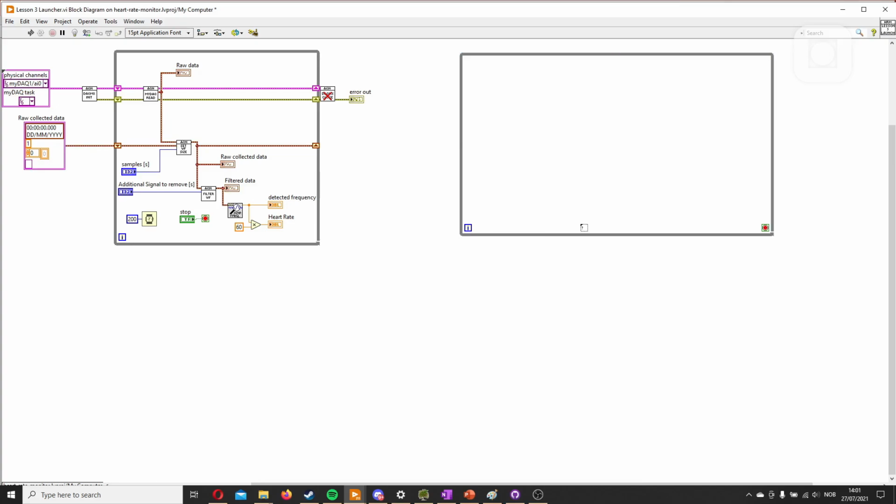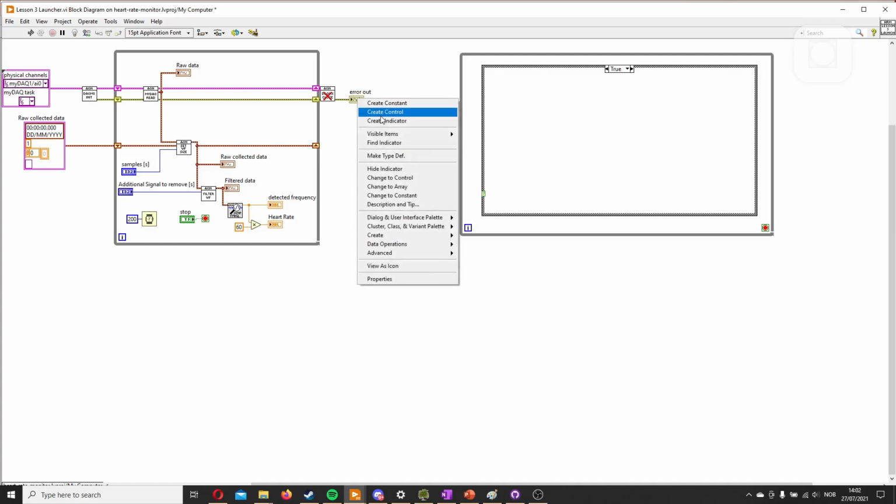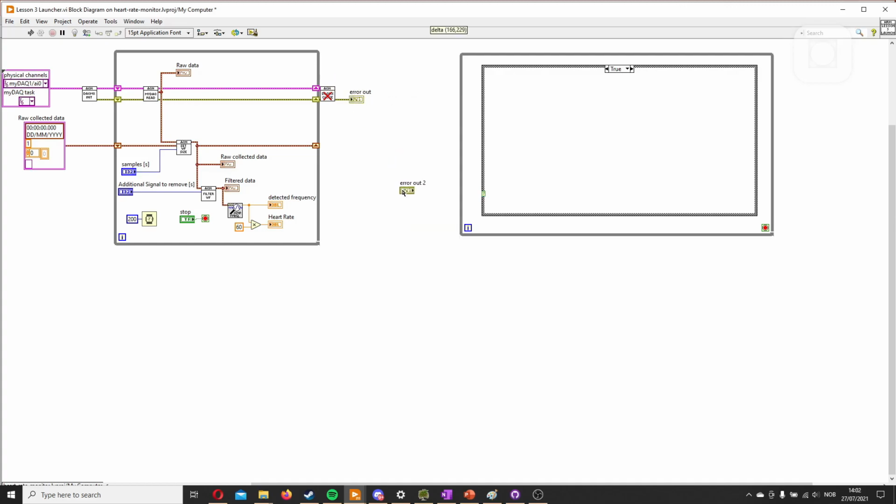Inside the while loop, we want a case structure. This case structure will just shut down this loop if there is an error. The point of this is because when you have multiple loops and there is an error in one of them, it is good practice that they just shut down and not do anything, because this will alert you that something is wrong. And we'll hook up the error. You can just create a control from this one, call it error in.